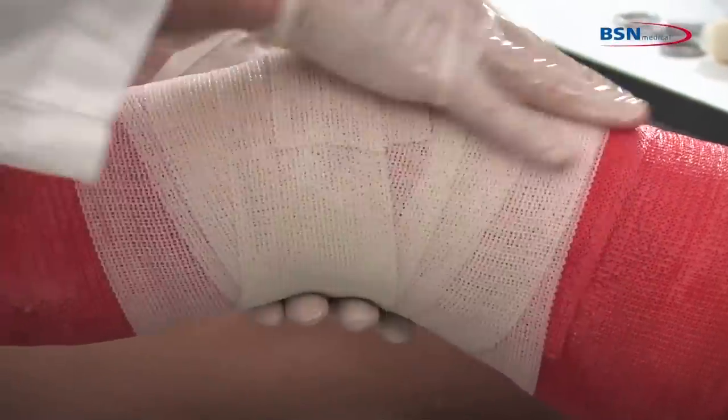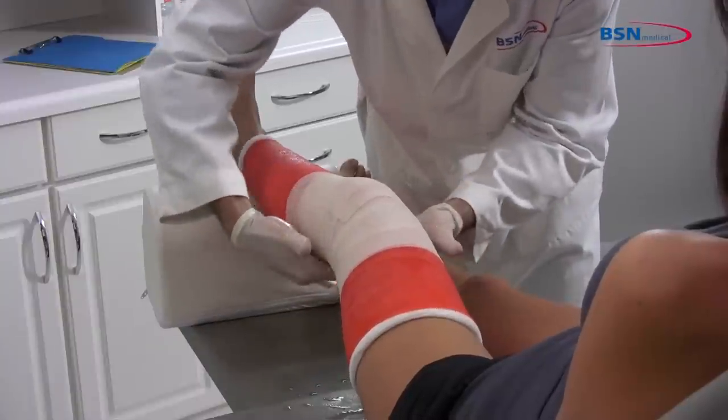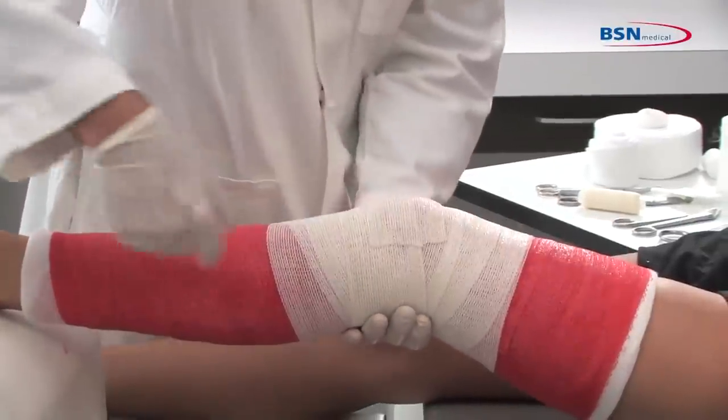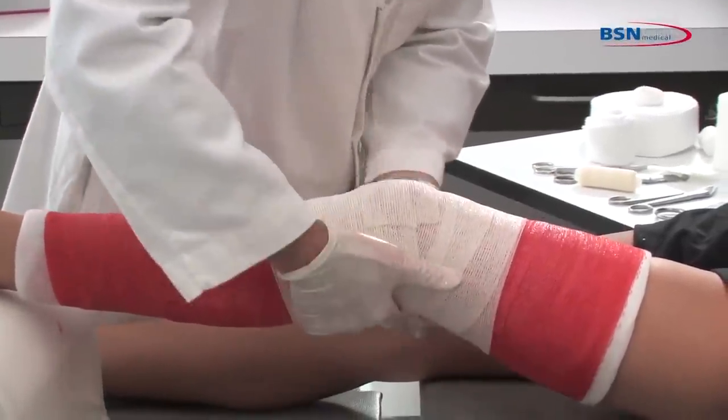Mold the cast with the palms of your hands. Check for any limitations in range of motion. Check for any pressure points that may cause irritation, and you are finished.